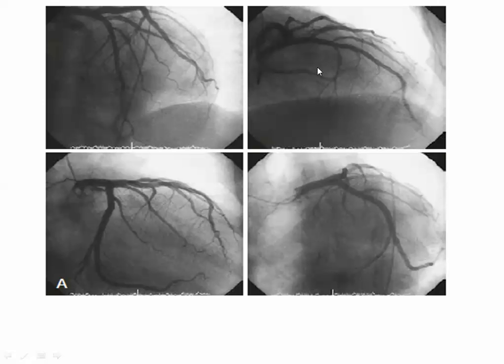Okay? So is it cranial or caudal? AP, cranial, because there is a diaphragm. So once it's cranial, you can see what? The mid and distal segment of this CX. But you can't judge or comment on the proximal segment. They are overlapping and foreshortened.